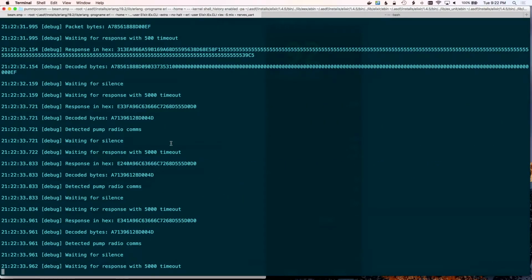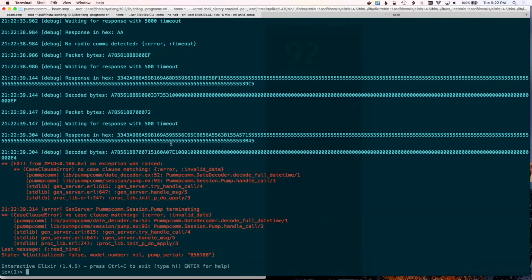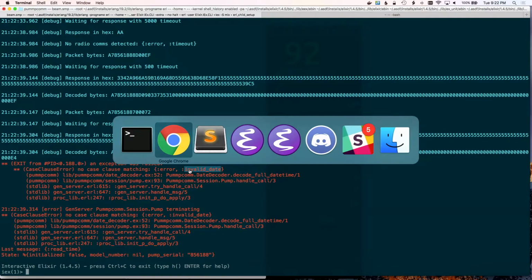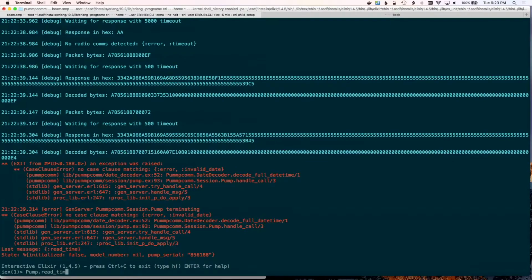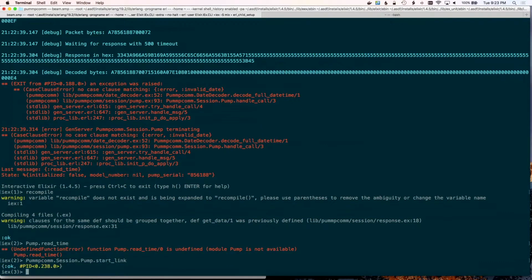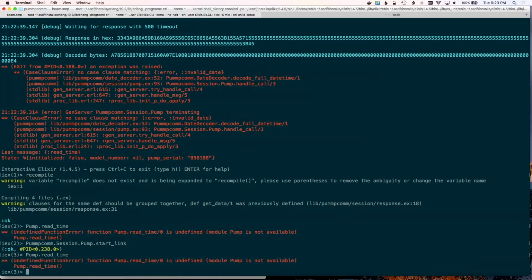All right, here we go. Oh, it's found another pump communicating. Okay. So it matched the response. That's good. Now I get this invalid date thing. I wish I could tell exactly what it is that it's passing in. I'm not sure why that's happening.